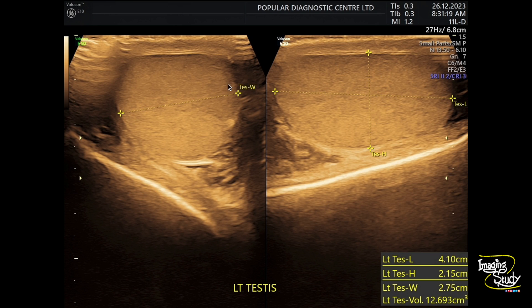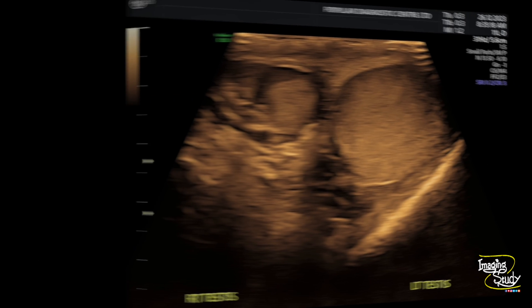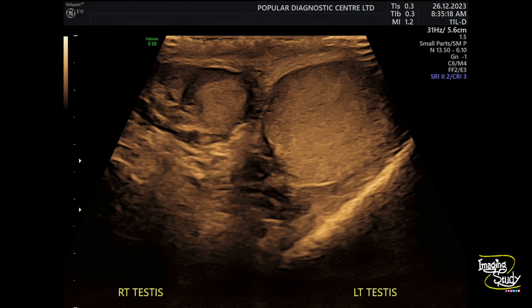This is the left testis. It's apparently normal in size and shape with uniform ecotexture. So if you make a comparison, you can see the right testis is significantly smaller than the left one.